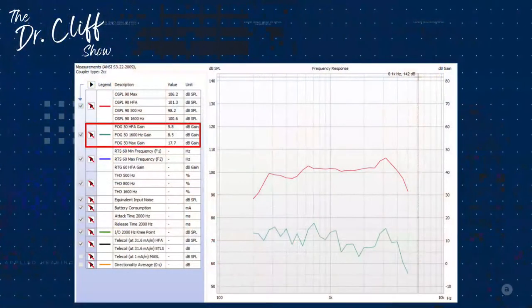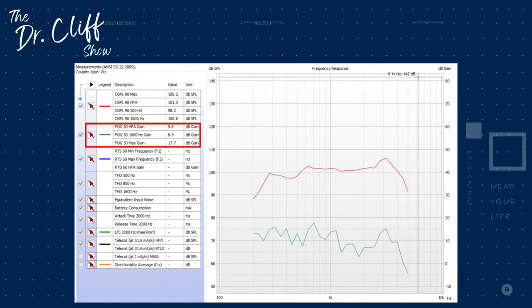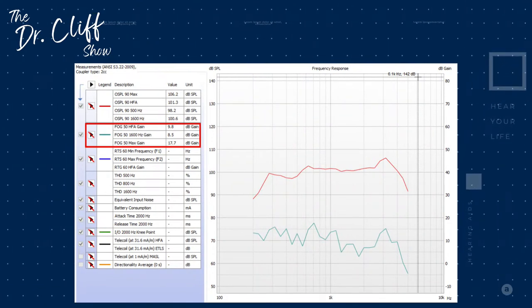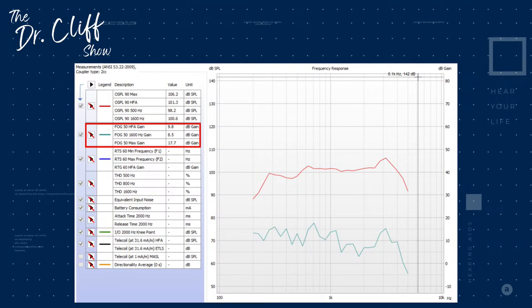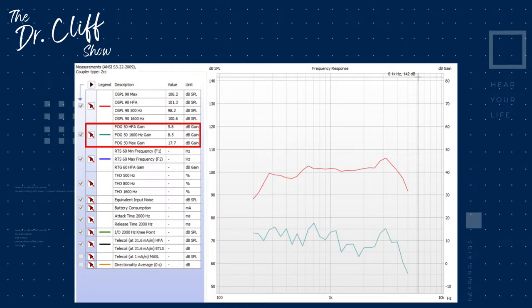And so the next one that we're going to look at is the full-on gain measure for that specific hearing aid as well. We were laughing earlier about this because the full-on gain for this hearing aid very likely was supposed to be around 60 to 70 decibels. And you can see that the high-frequency average at least clocked in at a whopping 9.8 decibels of gain, which means at an average conversational level, that hearing aid is probably operating more so as an earplug than anything.